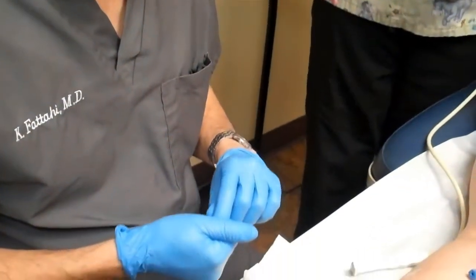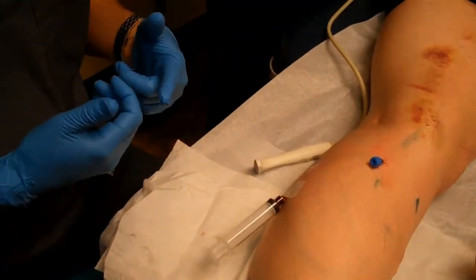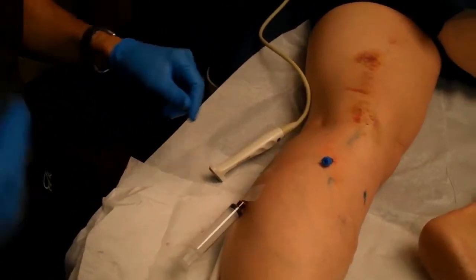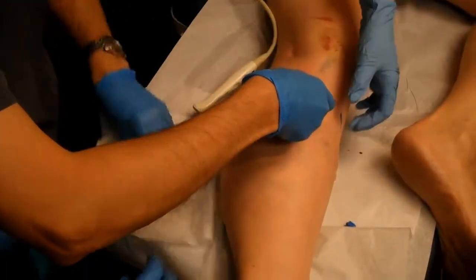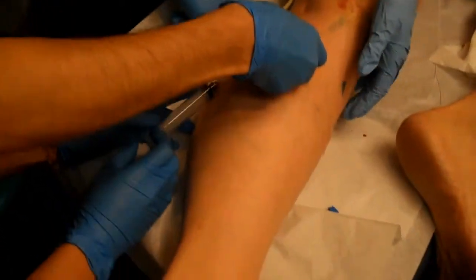This improves the safety of foam sclerotherapy, where foam does not have much chance of getting into the deep veins. We have not seen any case of visual disturbance or neurologic temporary disturbances for the last two years since doing foam washout sclerotherapy. The greater saphenous vein is already closed on top, as mentioned.